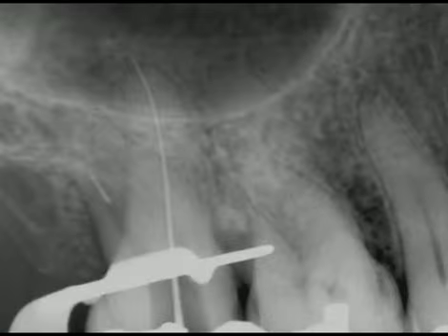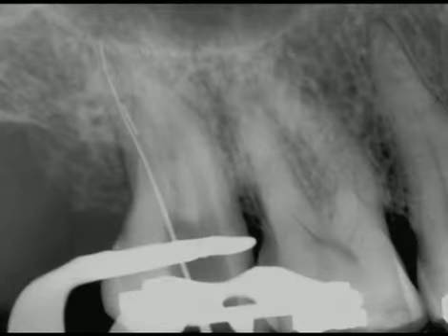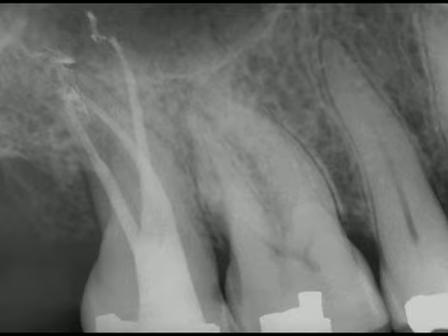Here is a working film of a maxillary right second molar. Notice a broken instrument in the DB root and an instrument that has negotiated the palatal canal. Notice in this working film I'm showing a more traditional method of bypassing the broken instrument with a small negotiating file. The postoperative film shows the retreatment efforts, and the broken instrument has been entombed during obturation.